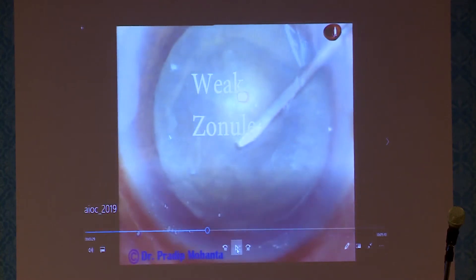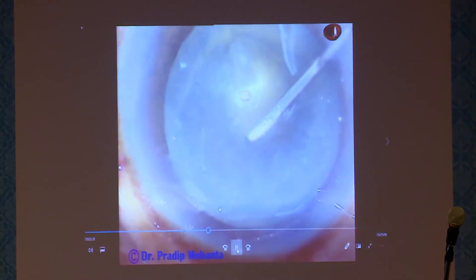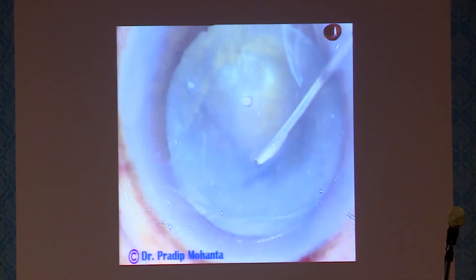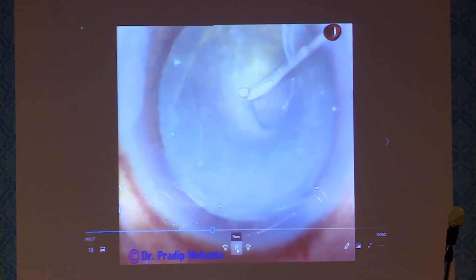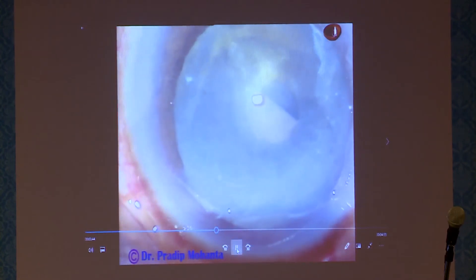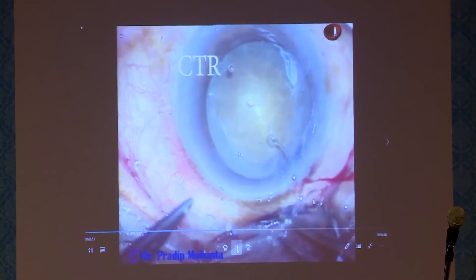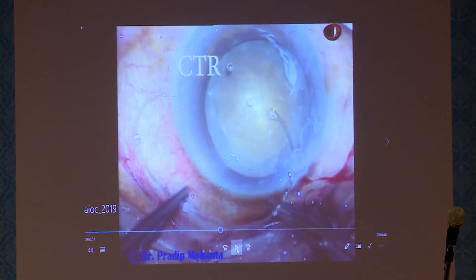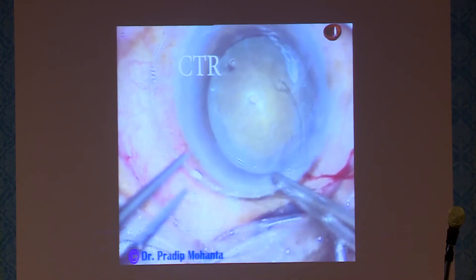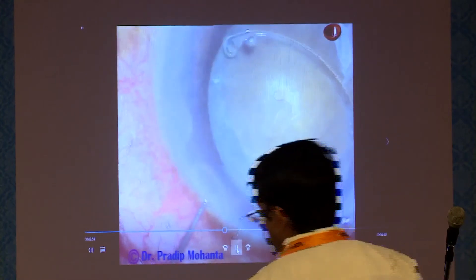If it is a hypermature Morgagnian cataract, see what happens if you just touch the capsule. Can you see some wrinkling and wavy things on the anterior capsule? If that happens, always be sure that there is weak zonule. In such cases, always use a capsular tension ring before nucleus management. When milky fluid comes out, you don't have to make a small rhexis first; you can aspirate the milky fluid through the puncture itself — it doesn't extend. After making an adequate-sized rhexis, place the CTR.